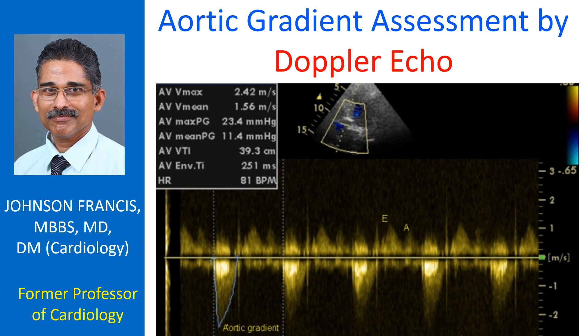Such mild elevation of trans-aortic gradients may be noted in hyperdynamic states like severe aortic regurgitation. But here there is no aortic regurgitation seen on Doppler echo. Similar gradients may also be seen across normally functioning prosthetic aortic valves.